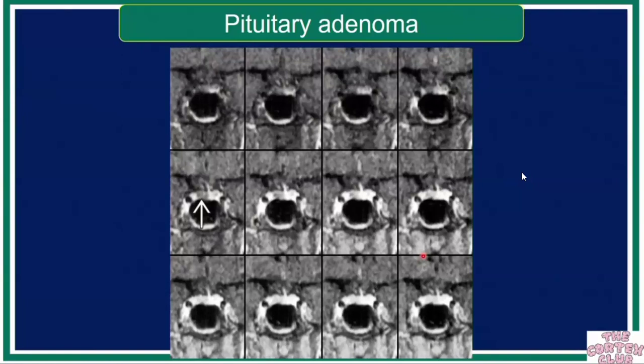And again, the rationale is that dotatate, because it is a somatostatin analog, binds to the pituitary tissue, and the pituitary enhances with dotatate administration. And if there is a microadenoma, again, it will appear as a filling defect against that avidly enhancing pituitary gland, because all the tracer will be taken up by the gland itself, and the adenoma is not going to take up that tracer.